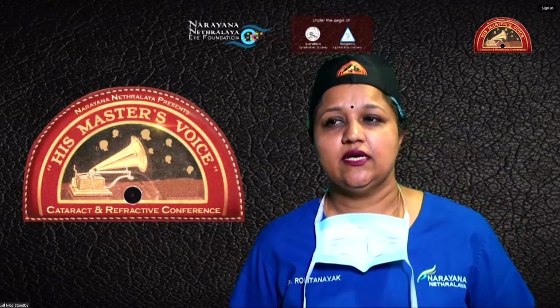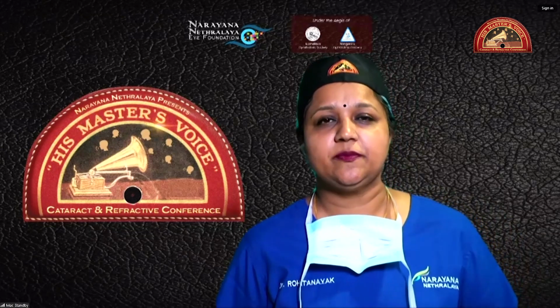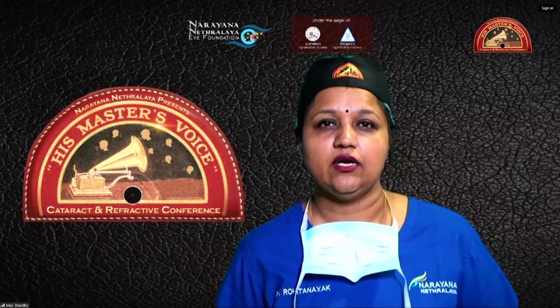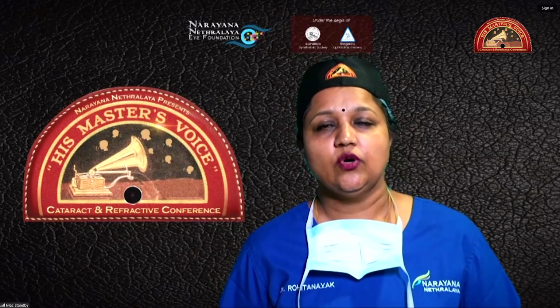So we have Dr. Rohit Prakash with us, a humble soul who radiates warmth with every smile, who will show us how to handle a high myopia case. The axial length of this patient is 31.65. He will be using the Centurion Phaco machine and will operate on low IOP settings, and will be using the Zeiss microscope. Over to you, sir.